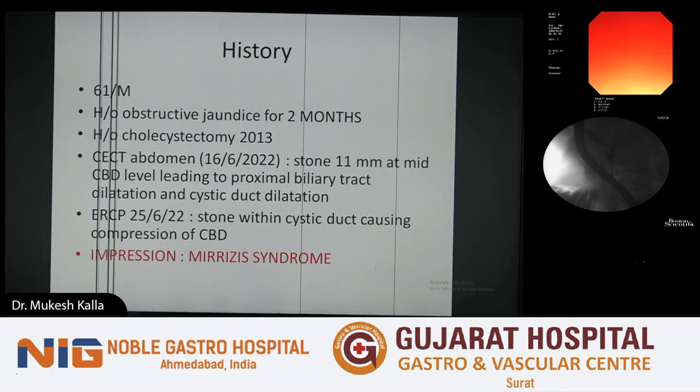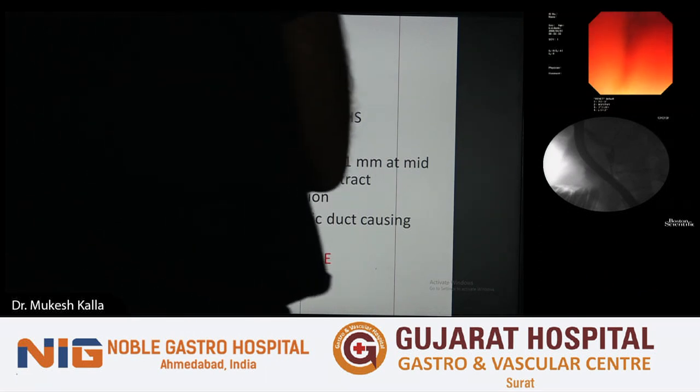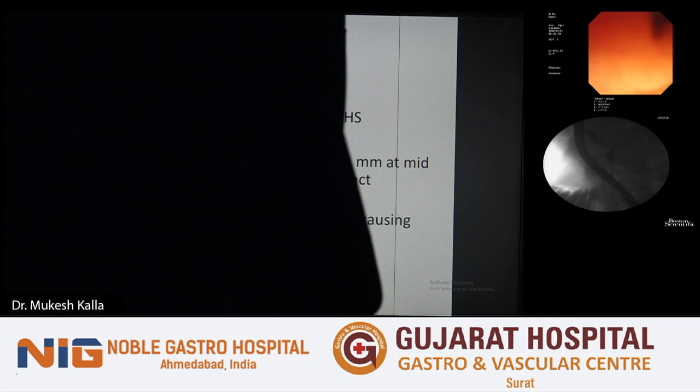Yeah, one question from the audience. Can we do balloon dilatation with a 15 mm CRE balloon if the CBD is 10 mm in diameter? I don't think so. You should not go too much beyond what your CBD diameter is.